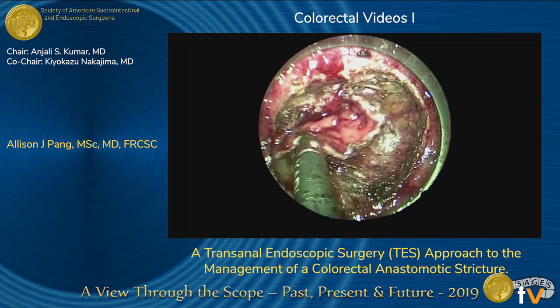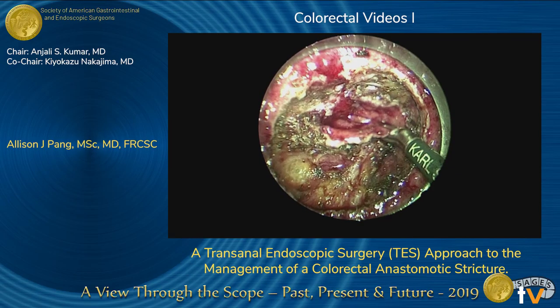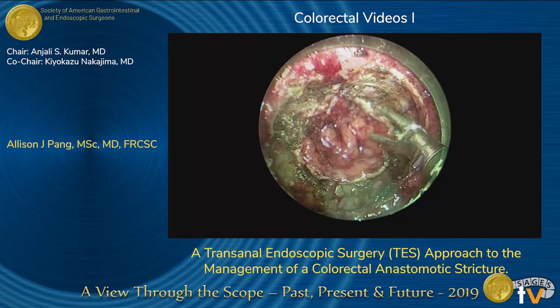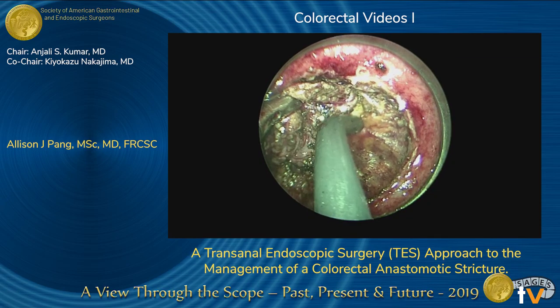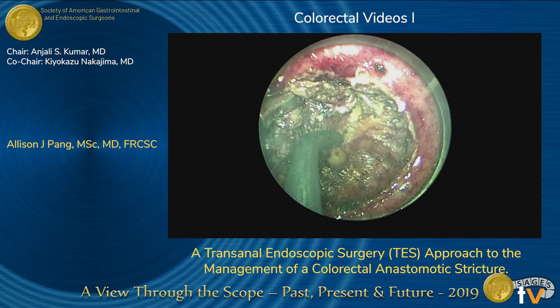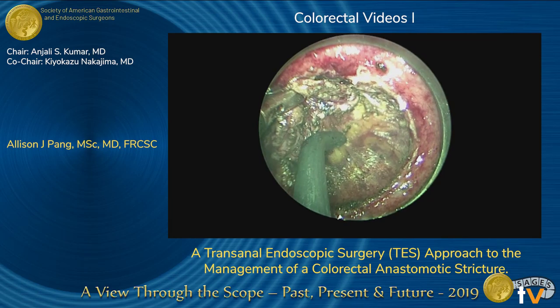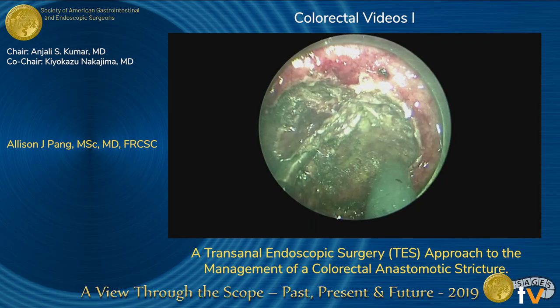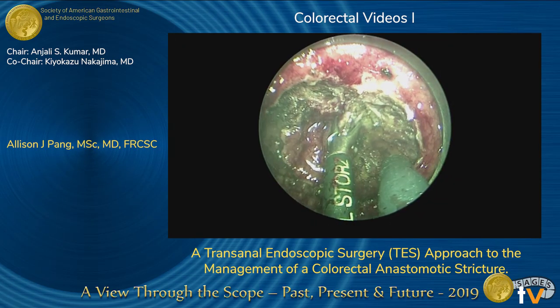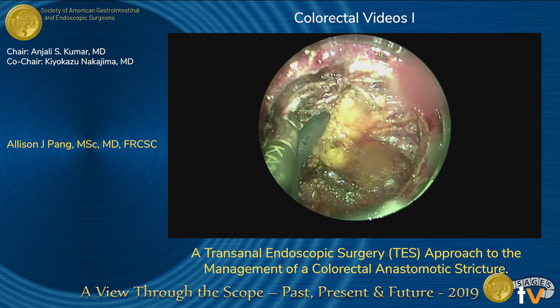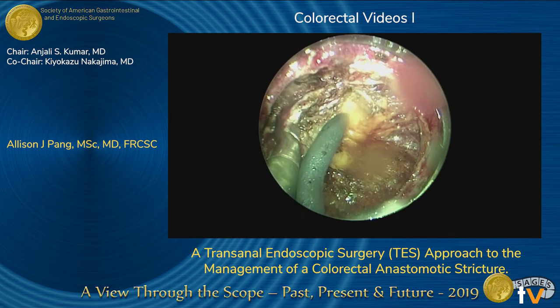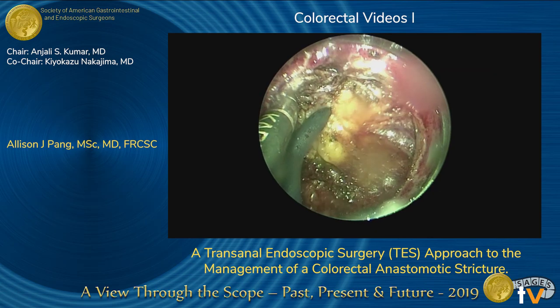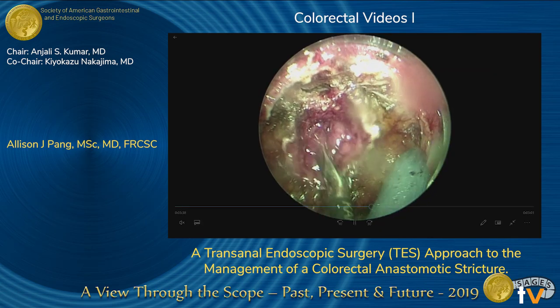We then began our resection, carefully dissecting layer by layer circumferentially until we reached the mesorectum. We did not dissect any further than the mesorectum, as a TME dissection was not indicated or required for this procedure. Here you see us dissecting the stricture off of the mesorectum, and you get a sense of how tight the stricture is and its short length.